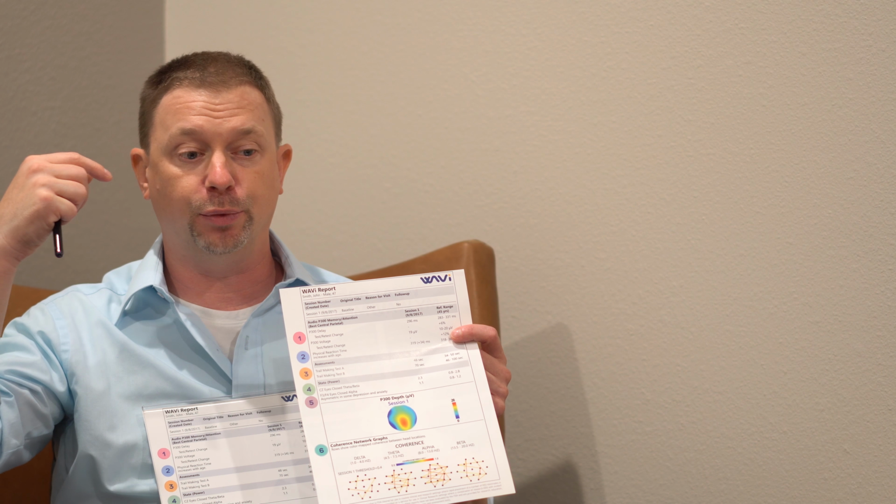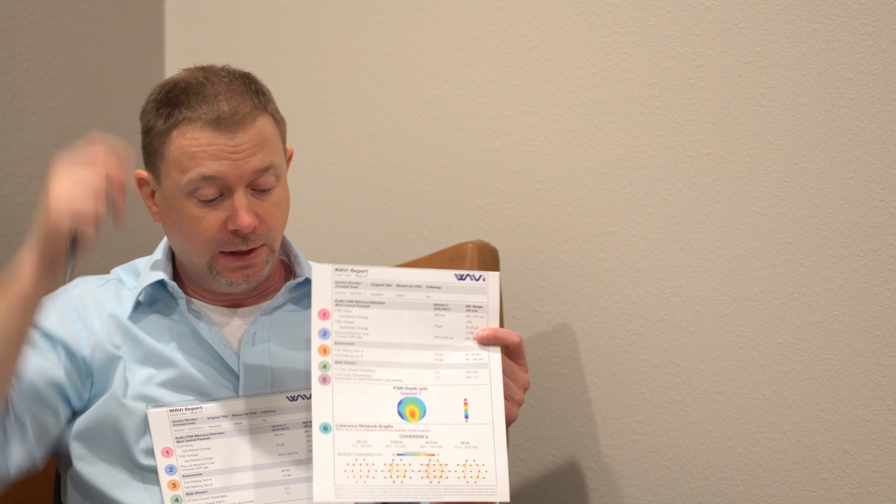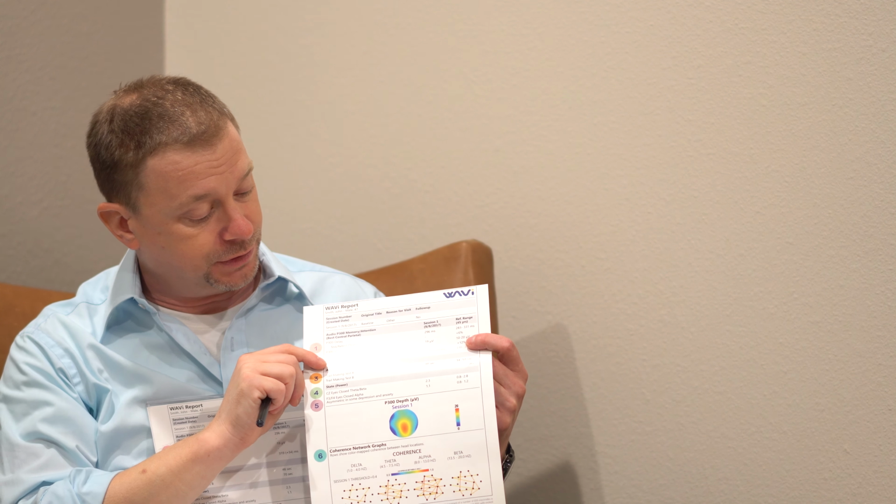The next part is the voltage. The P300 also has a voltage. There's a certain amount of voltage that should be firing through different regions of your brain, but mostly centered around the top of your head. Those voltages should reach a certain level. They shouldn't be too high and they shouldn't be too low. A lot of people with a brain injury end up being too low, and those patients don't do very well because they just don't generate the voltage that they should when they hear that oddball sound.